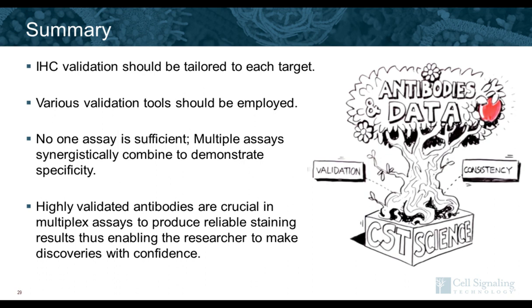All of the antibodies we displayed in the talk today were raised in rabbit, and for this reason, they're great choices for use in mouse tissues. If you are required to use a mouse monoclonal antibody in mouse tissues, for example, if there's not a good rabbit monoclonal available, there are some commercially available mouse-on-mouse reactivity kits that could possibly be used to limit mouse-on-mouse reactivity.